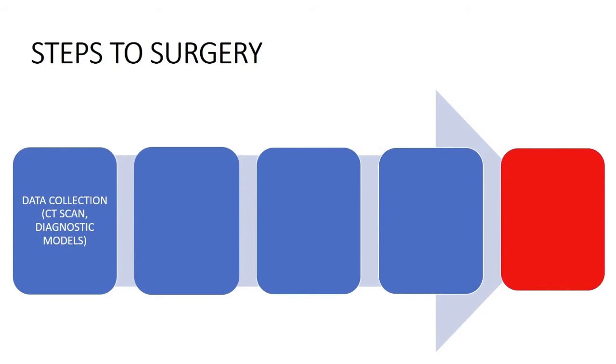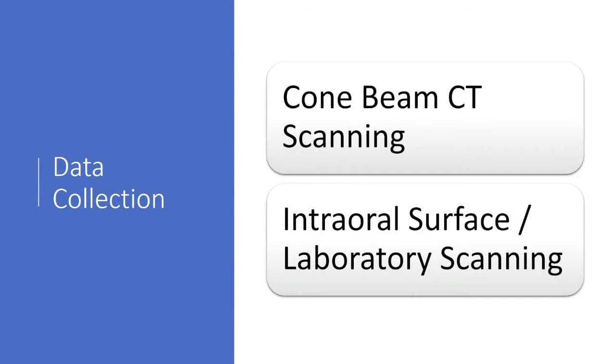Okay, so we want to get to surgery. The patient comes in. The patient's eager to have their implant placed, or maybe not their implant, a tooth made. So what do we need to do? Step number 1 is we need to collect the data. What's the data? We said it's the CT scan and diagnostic models.